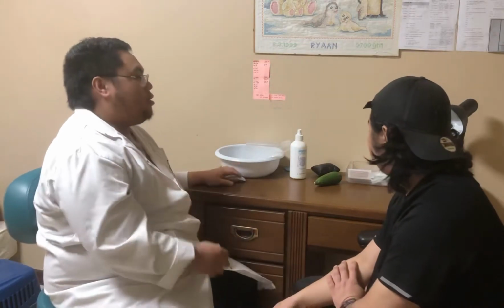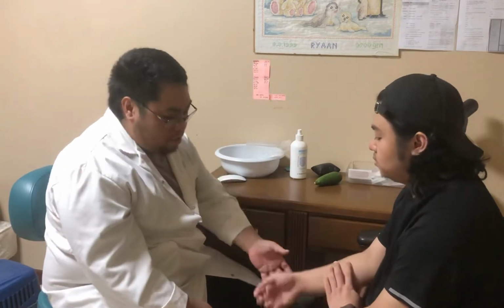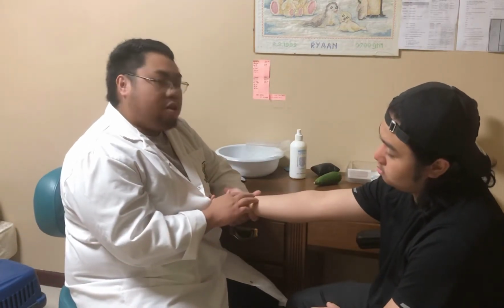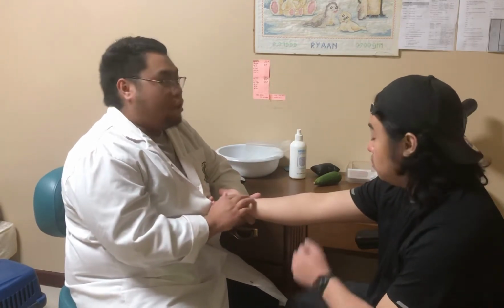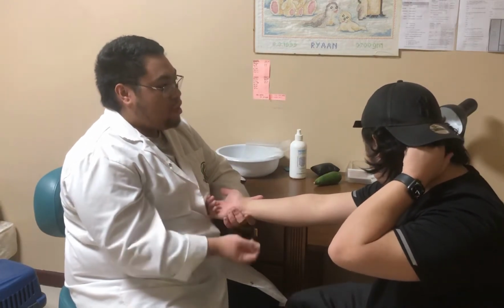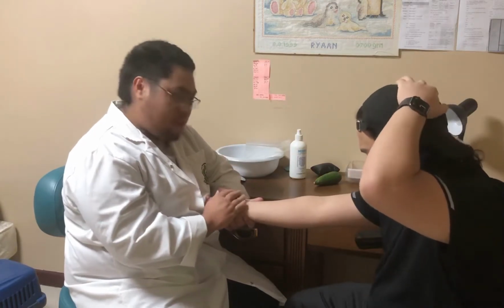Okay, after introducing the patient to the matters, we're going to be selecting the site. So here we're going to be selecting the radial artery. The radial artery is a small artery, however, it is easily stabilized as it is located in the bone groove of the wrist. The percutaneous puncture and the pressure control are enhanced by this anatomical mark.